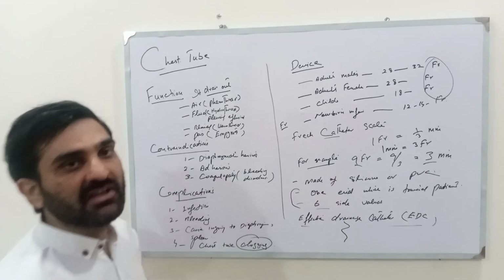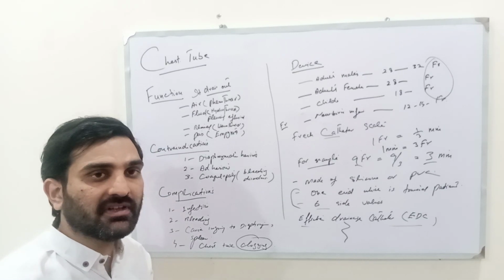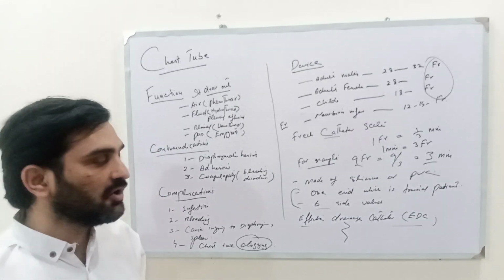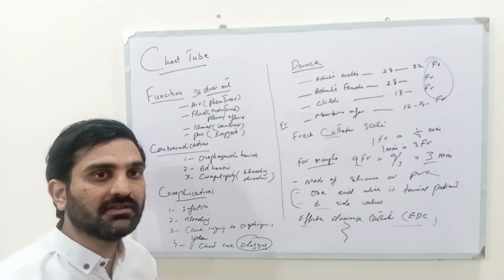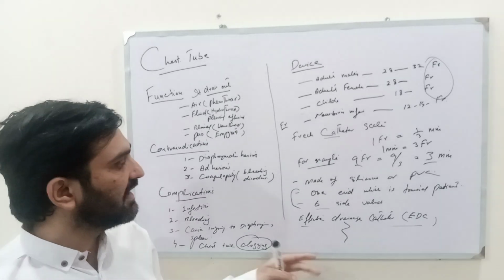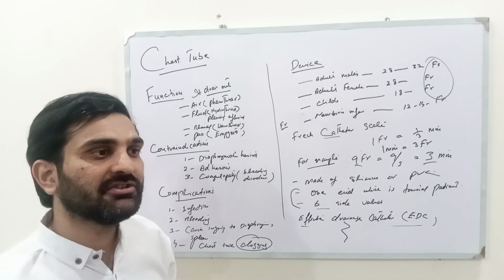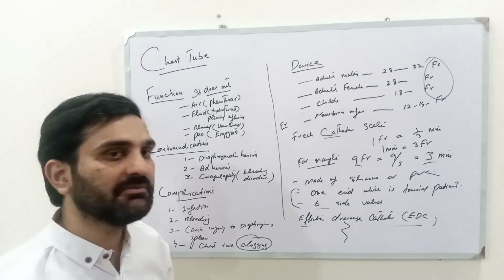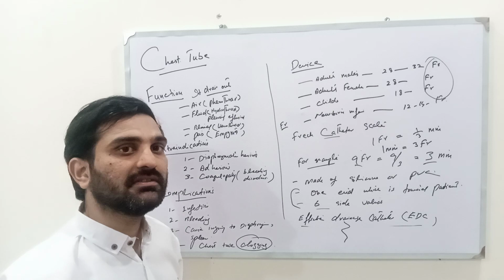Next we will discuss two most important things. One is the thoracostomy procedure: what is the exact location where chest tube is inserted into the chest cavity, pleural space. And another is what are the chest drainage systems which are in use, and what is the mechanism of chest drainage system.